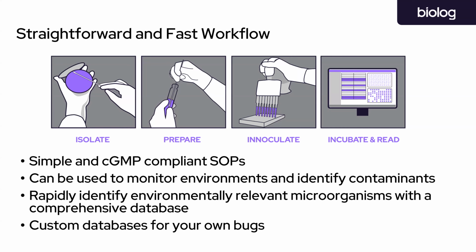And in every well, if the organism is able to use that substrate to grow or metabolize, then the dye changes color. And then in some wells, there's inhibitors. So, same thing there. If the organism can survive in the presence of the inhibitor, you will also see the well change color. So, these plates have been designed in a way that each organism at the species level will show a unique pattern on this combination of compounds. So, it's kind of like a distinct fingerprint. And at each interval, Odin reads the plate and tries to match the pattern with something in our database.